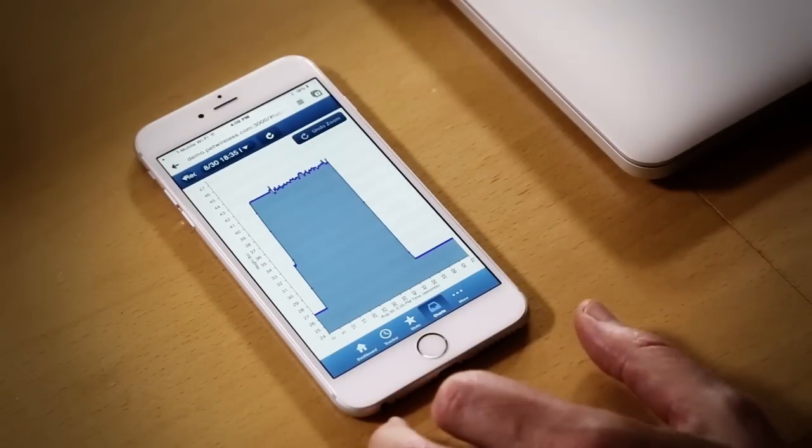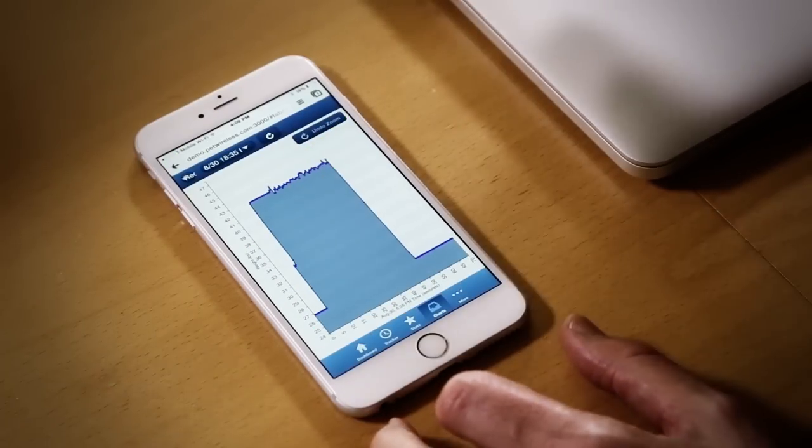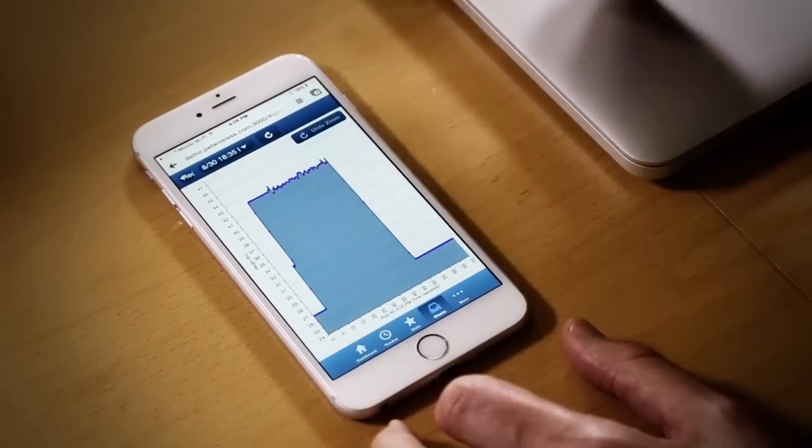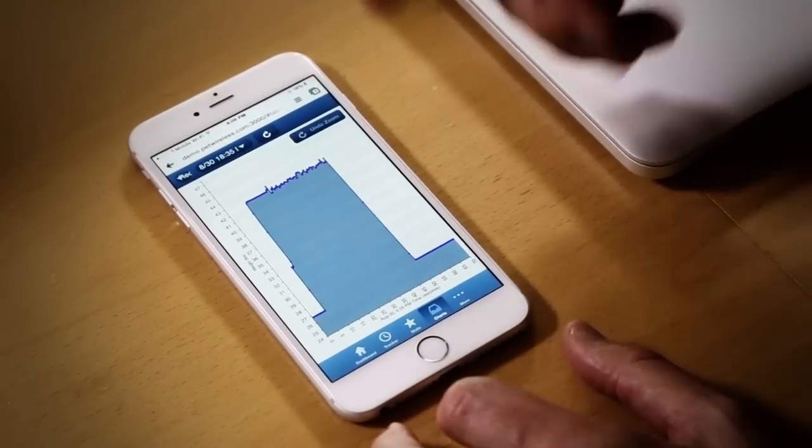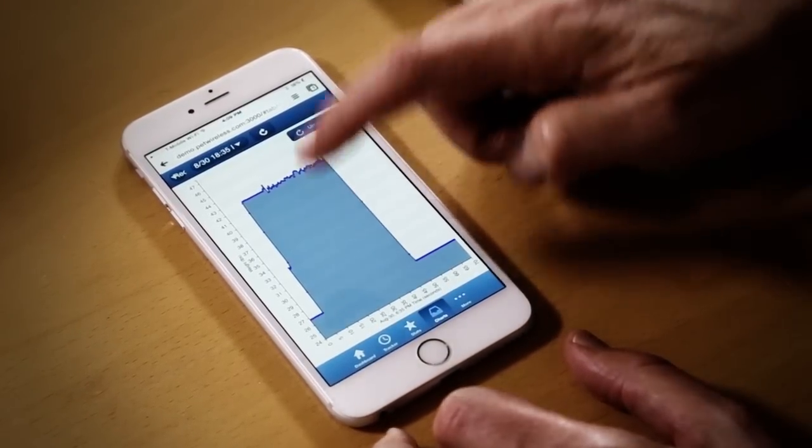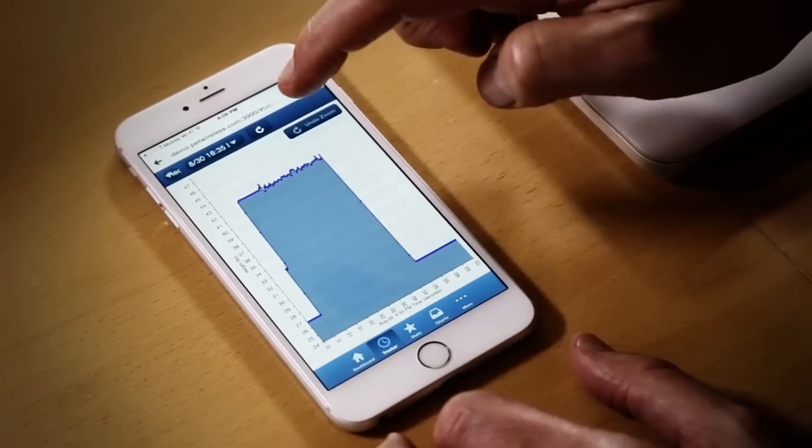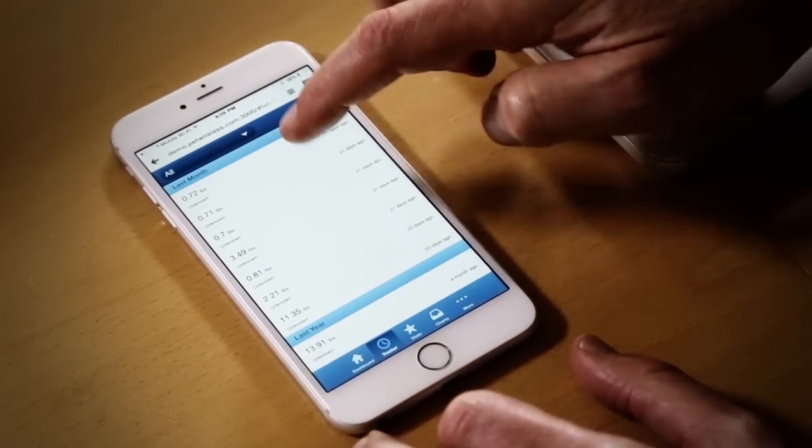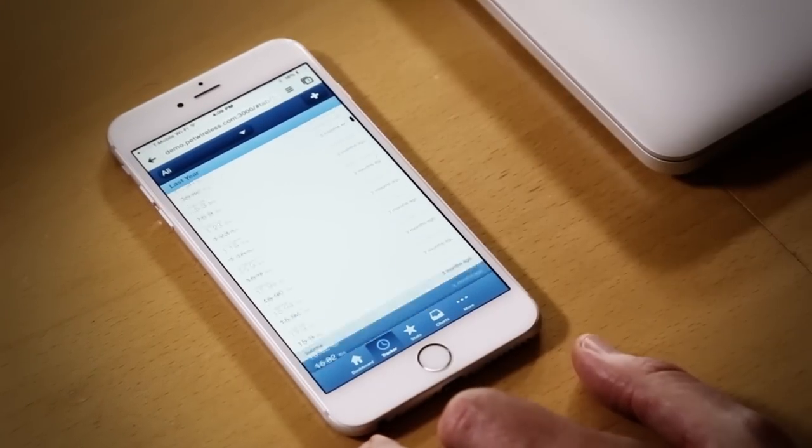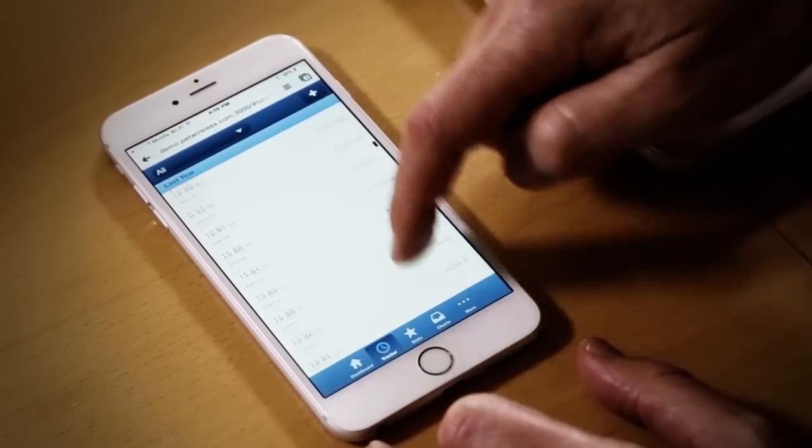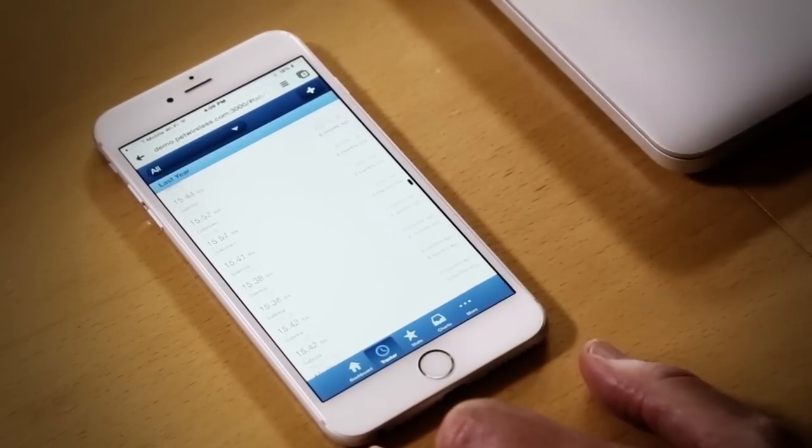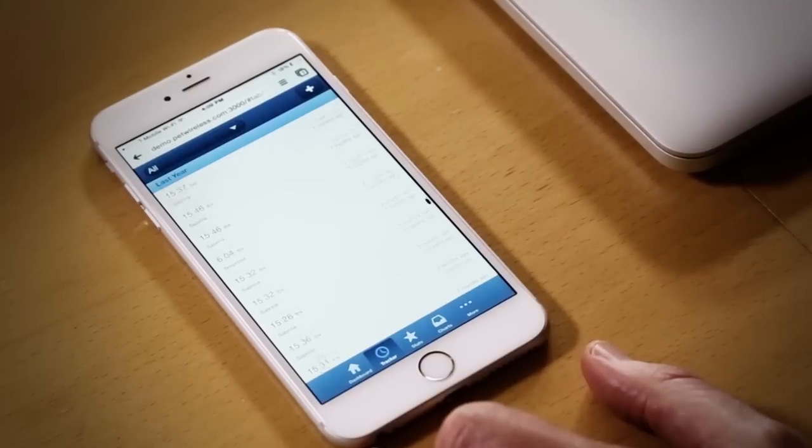Here's the data of the same event we just saw on the laptop, now inside the mobile app. So let's see Bella's history of visits. These are all the past visits, so you can go back and see the entire history.